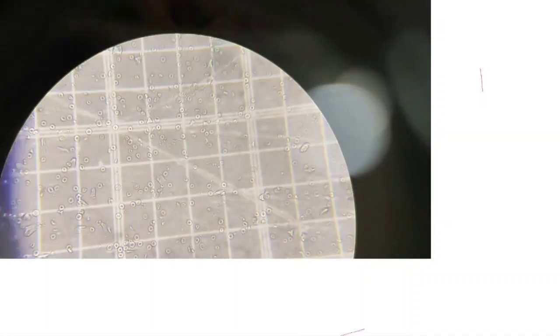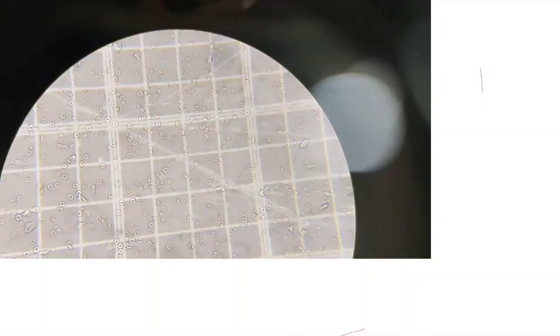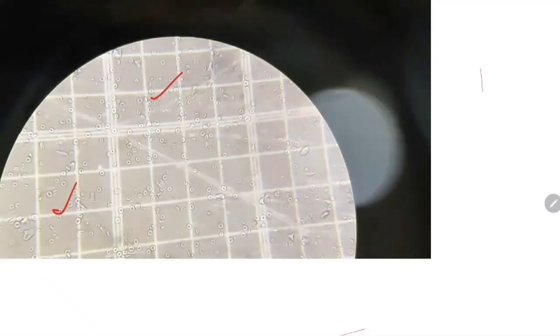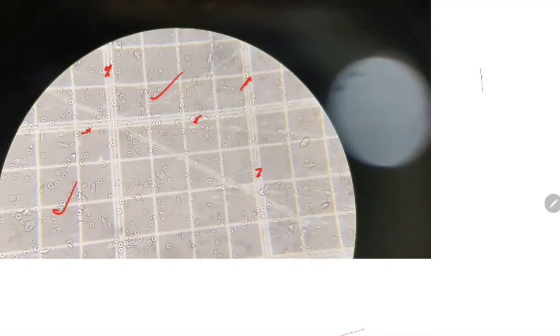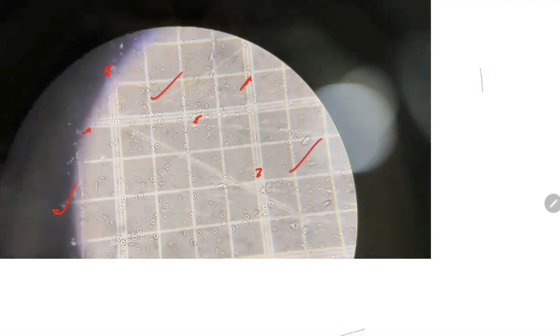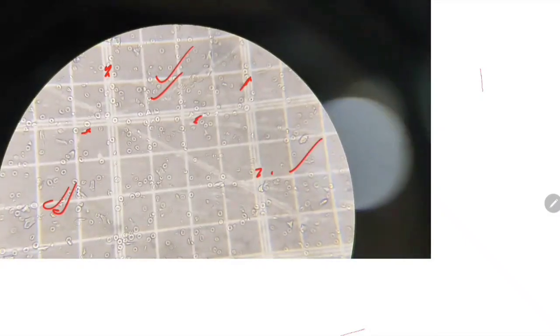So this RBC is focused, and we can see this is one RBC counting area, this is another RBC counting area, because the triple line is here, and this is a triple line, this is a triple line. So these are actually the RBC counting areas. These are different RBC counting areas, and we know this is 40x. Now this is actually 10x, that's why we can see the bigger area.